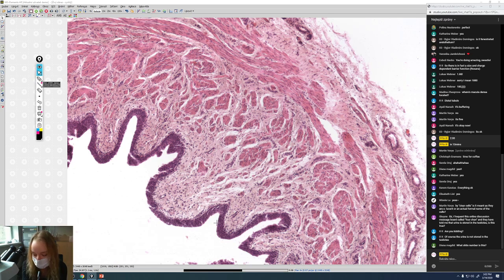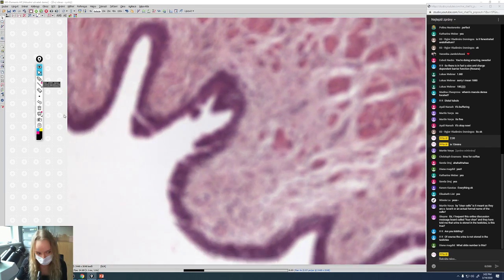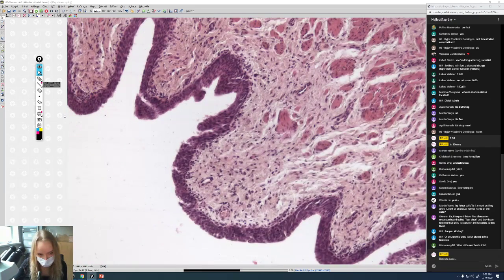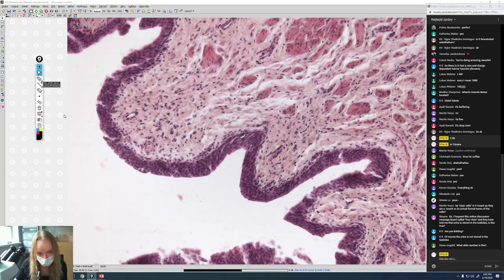Slide number 56. Okay, and now we're going to focus on mucosa. Yay! So it's quite pretty.